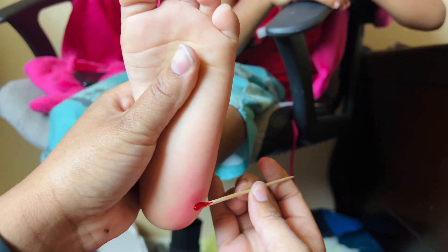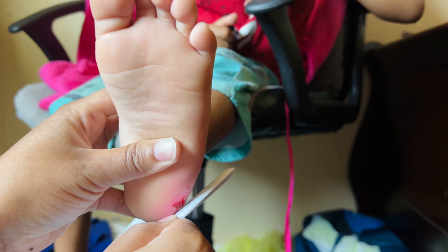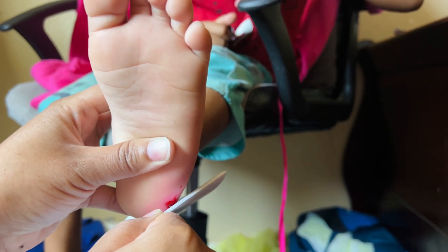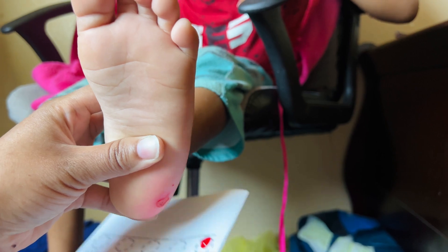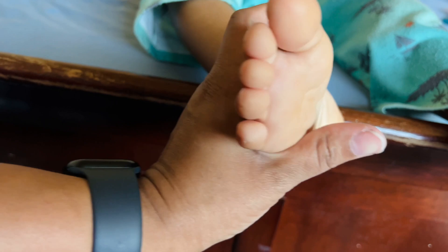I'm using food dye for demonstration — this is not real blood. You're going to place the paper close to the baby's foot without letting the foot actually touch the paper, just letting it catch the little drop of blood to avoid contamination. One good drop of blood will be enough to fill the circles on the screening paper. If not enough, gently squeeze the baby's heel a little more, then repeat for the remaining circles.